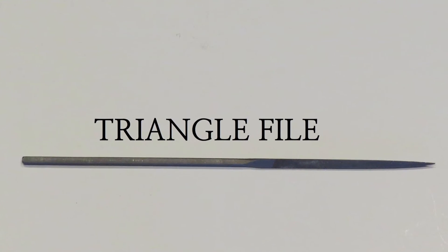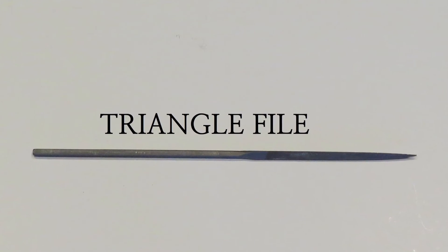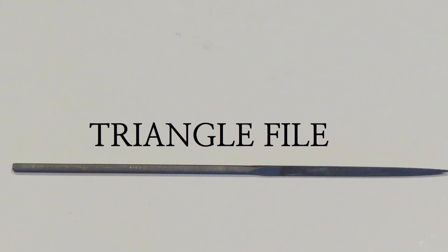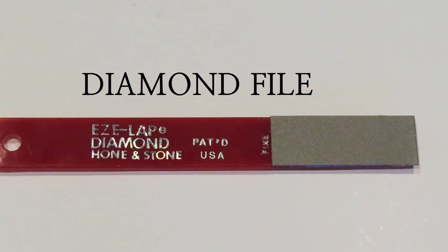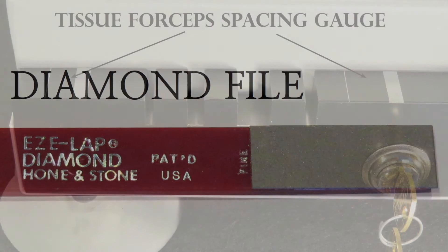Triangle File and Diamond File: These files are used to remove metal from surgical instruments. The triangle file is used to restore the teeth on tissue forceps and the teeth on the jaws of ring forceps. The triangle file and diamond file will be used to remove burrs. The diamond file is used for heavier metal removal. Note that the triangle file only removes metal when it is pushed in one direction.